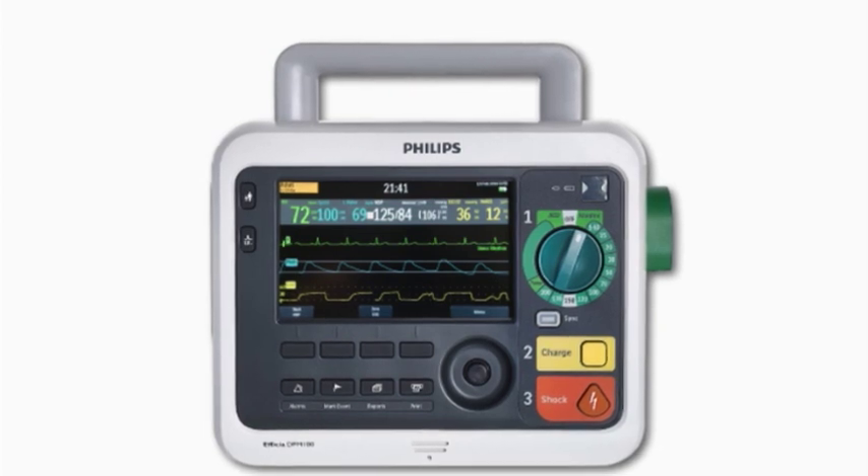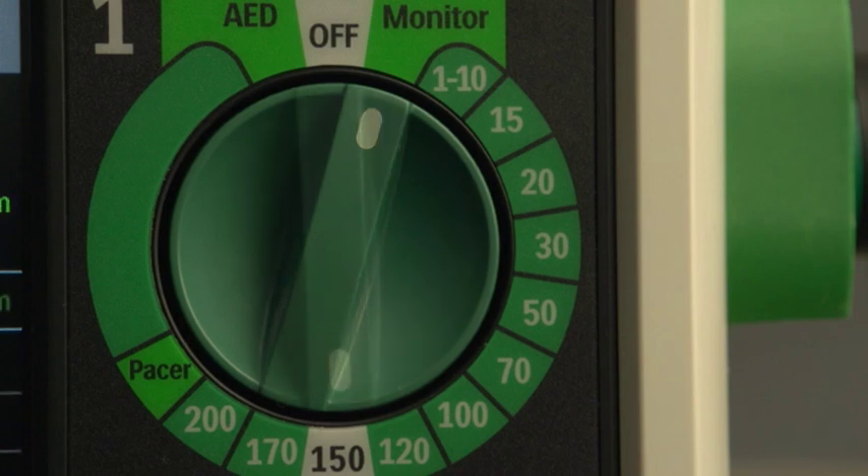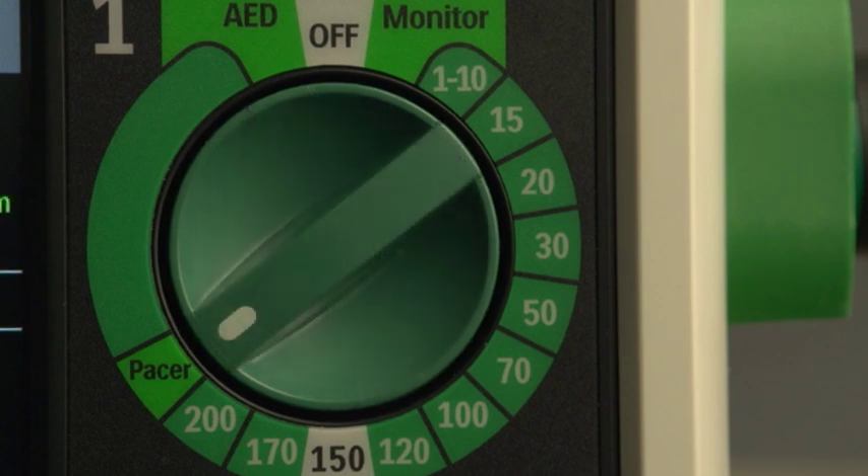The DFM100 provides four clinical modes of operation: Monitor, Defibrillation Synchronized Cardioversion, Optional Semi-Automated External Defibrillation, and Optional Pacing.